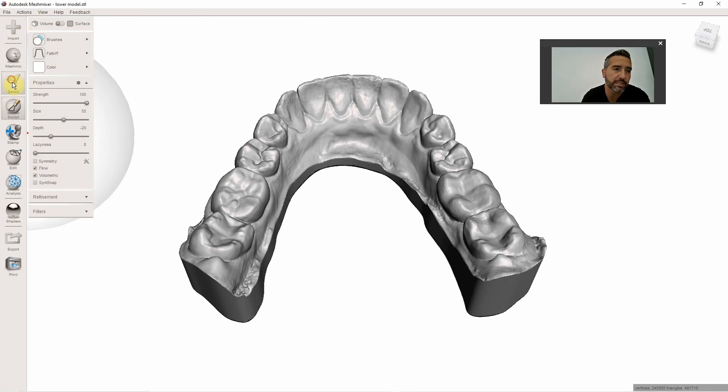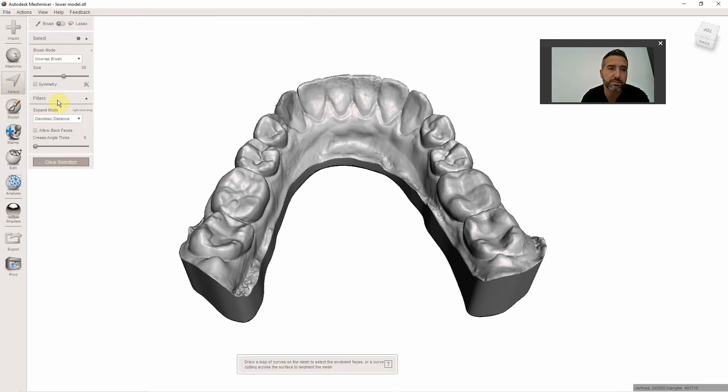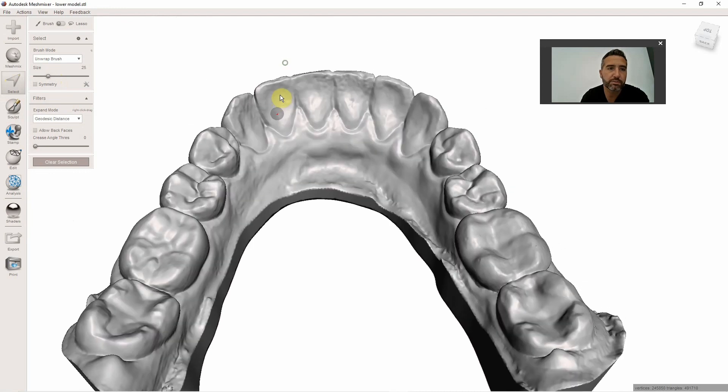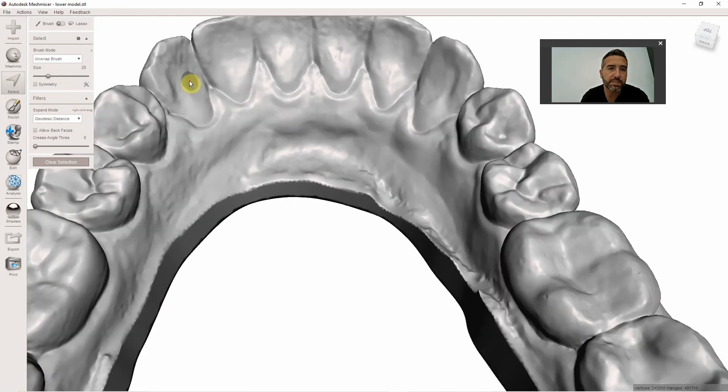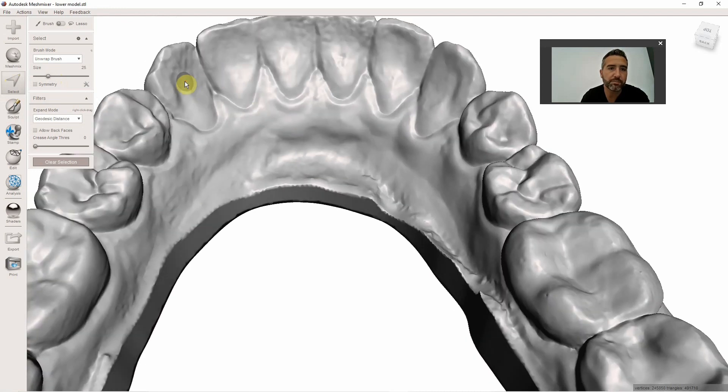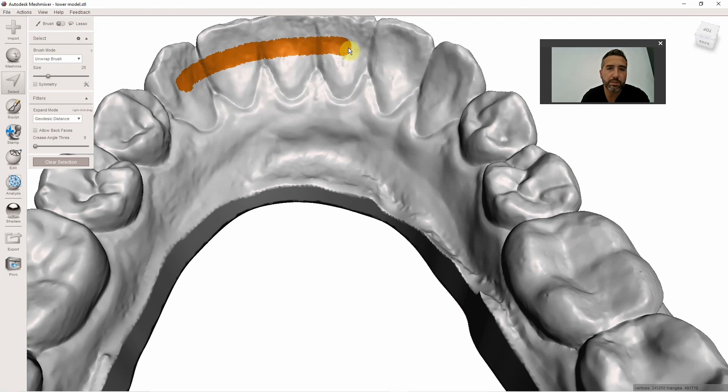You go to your select tool in MeshMixer. By the way, MeshMixer is free software you can download from the Internet. Put your size to where it's nice and small, and come in here and create a lingual bar.